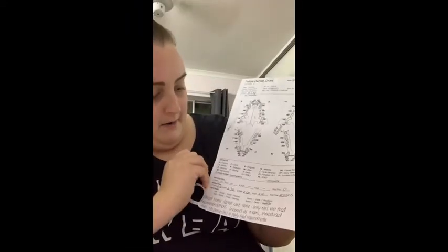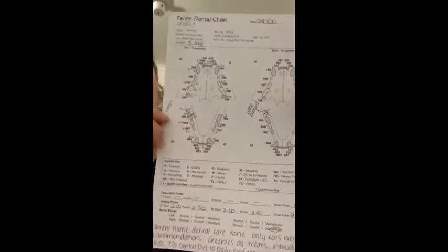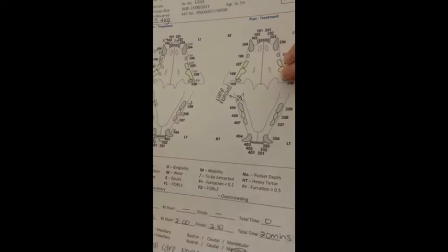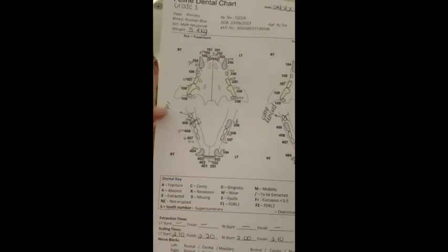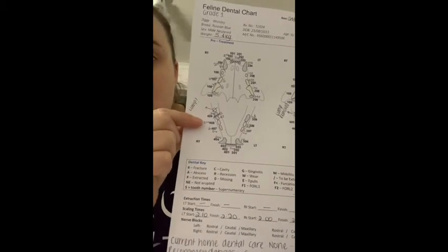We've got our dental key here, so that goes through all the different, I'll just zoom in a little bit so you can see, and we've got the pre-dental here. So this was charting during the anaesthetic of this animal.